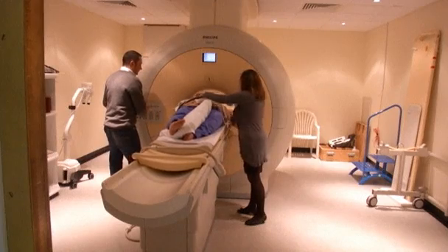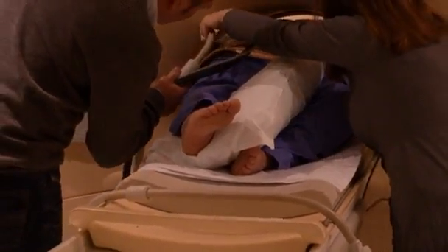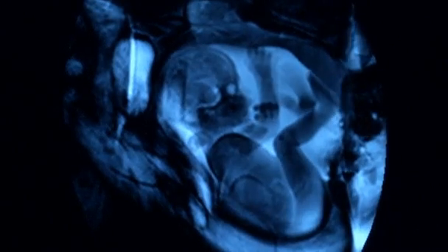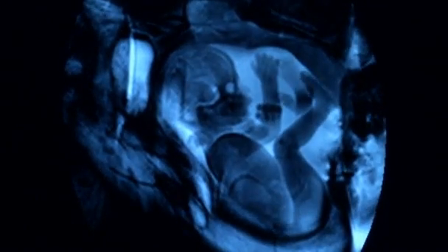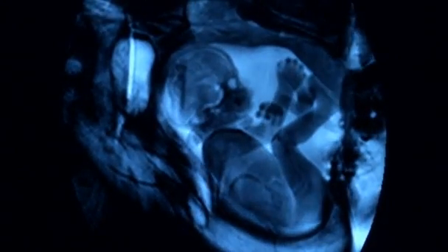The scan uses a technique known as oversampling, which provides a far more detailed picture than conventional MRIs. What we do differently is much thinner slices of the brain, so the pictures that we take are of much thinner, just a couple of millimetre thickness regions, and we overlap them. So that means that even if the baby moves, we've oversampled the brain. So when we come back to looking at them, if we want to reconstruct a 3D volume of the brain, we've got extra data, which means we're not missing out any key regions.